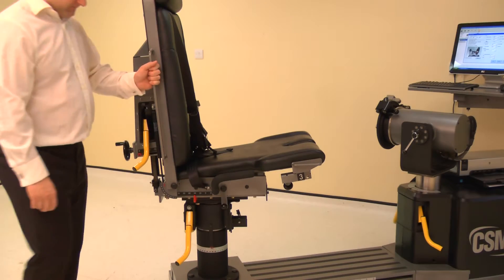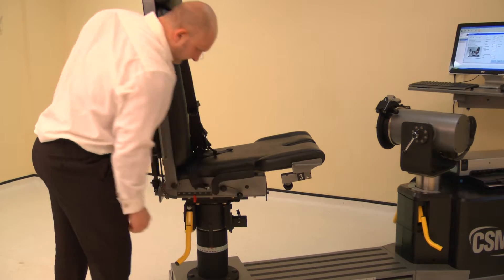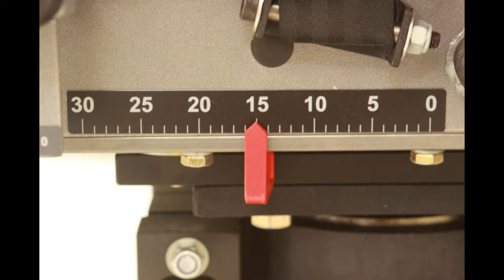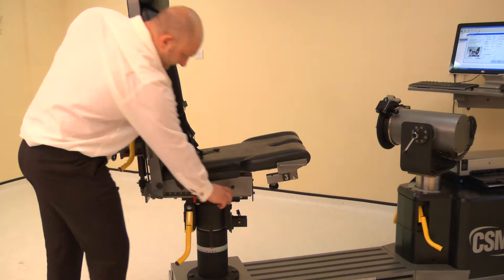The chair fore-aft is altered by raising either locking handle, then slide the chair bottom forwards or backwards. Adjust the fore-aft to position 15. Lower the locking handle to secure.